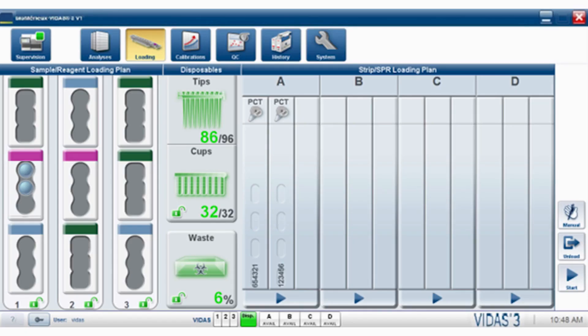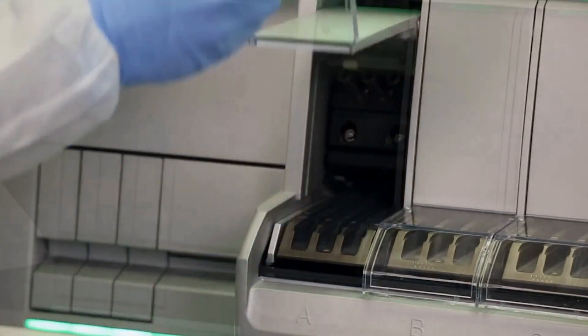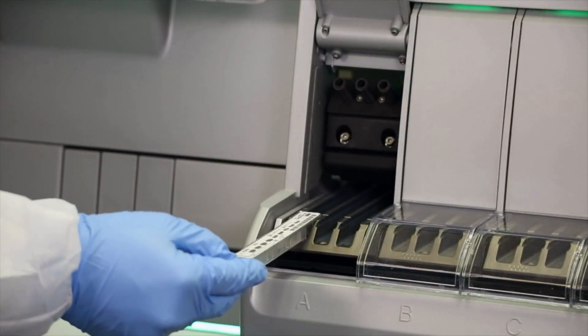Once in place, the loading screen reflects the reagents' locations based on their barcodes. Open the section door that the strips and SPRs will be loaded into.